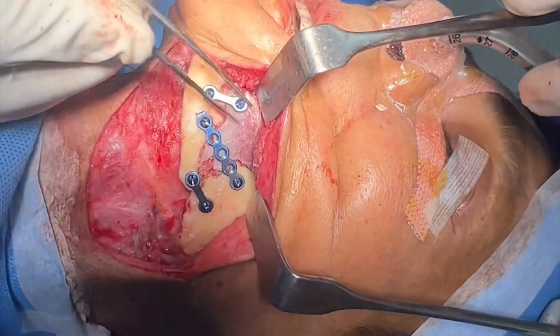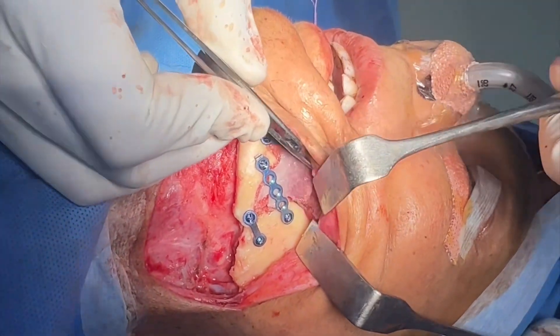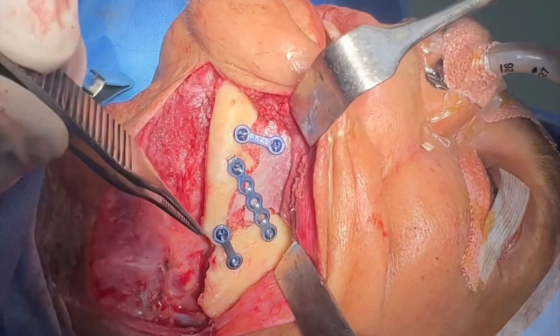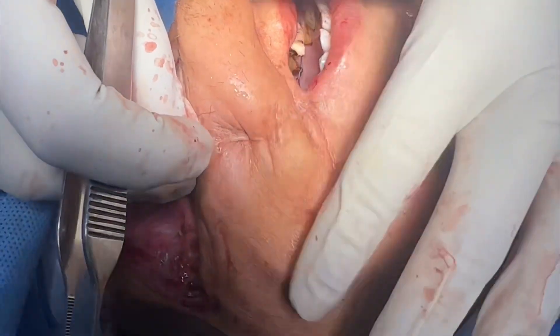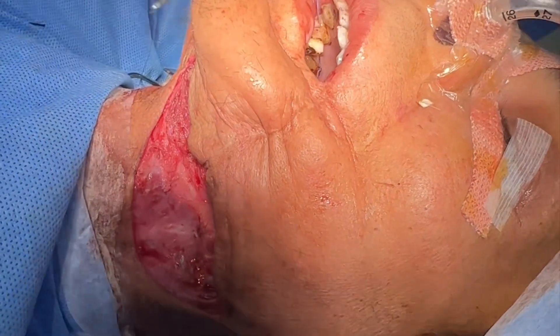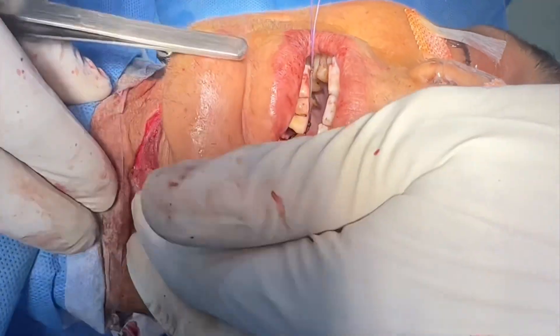This is not communicating into the mouth. We've done a very very delicate dissection to make sure this is all only on the exterior, so there's no communication from inside the mouth. It's got some scarring and tethering as you saw from the earlier procedure — we're not going to be addressing that now. We're just going to be suturing this up for the day.